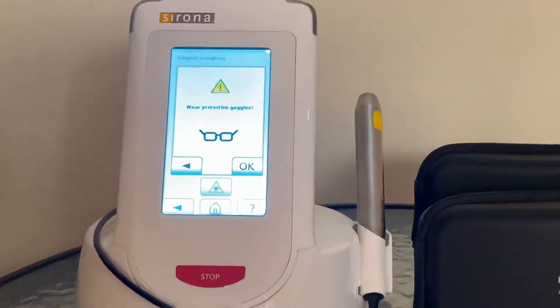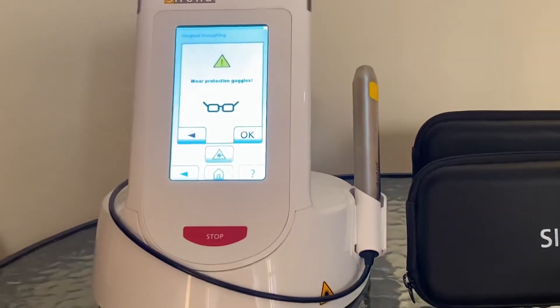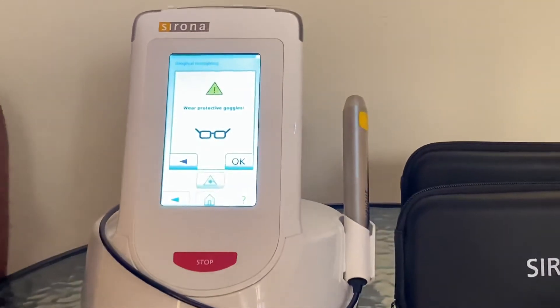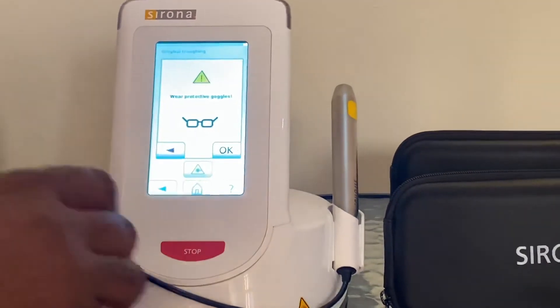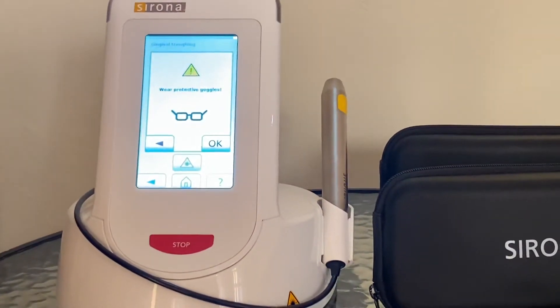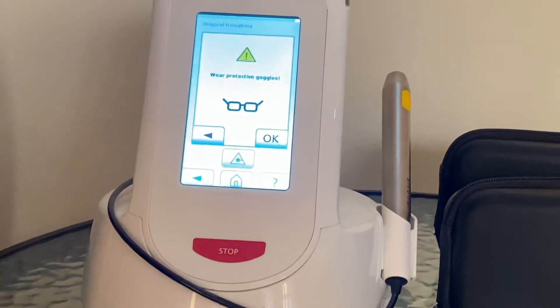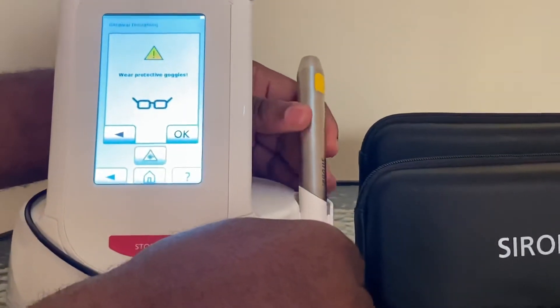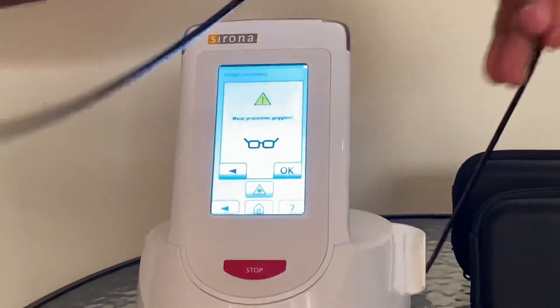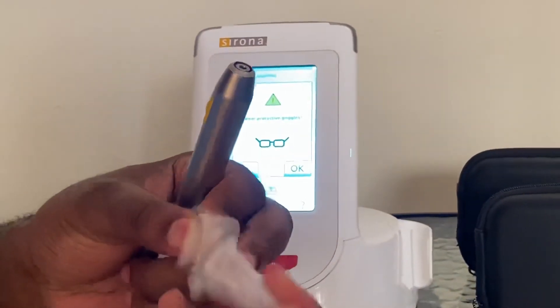Everyone in the room must put on protective eyewear — otherwise they need to stand away or out of the room. Should anyone wish to remain in the room, they cannot look at the area where you're working. Now, there's something I'm about to do which will be wrong: you shouldn't start your laser machine and choose a program before you have inserted a laser tip. So let me pull off this cable for now. For the purposes of this demonstration, you ought to have picked a laser tip like I am doing here.